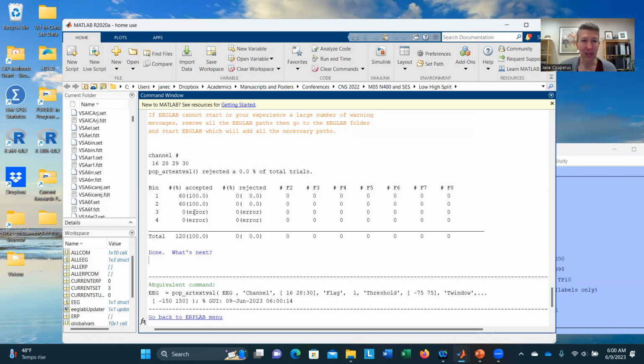And one of the things it's doing is it's telling me for these channels that I chose, how many of my trials were accepted and how many were rejected. So I set flag 1, and so that's why these 2 rows have come up. And it tells me for each bin, so each of these different bins that I have assigned, how many trials there are. And you might remember from when we epoched, we only had bins 1 and 2. We didn't have any errors, so we didn't have any bin 3 or bin 4, but we had 60 trials in bin 1 and 60 in bin 2.